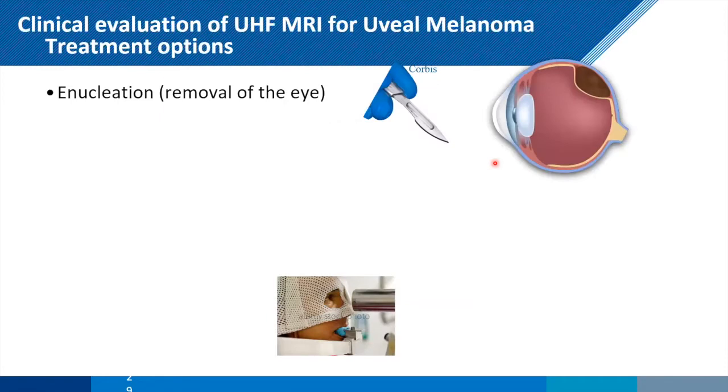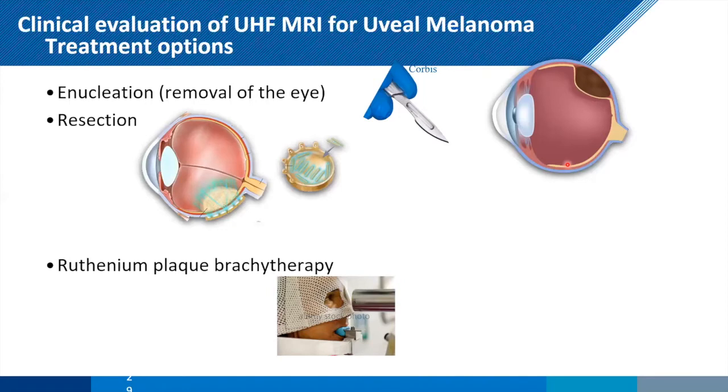And one example where it actually is used in patients and the results have an effect on diagnosis is looking at eye tumors. So uveal melanoma is the most common eye tumor. It's a horrific disease, mainly because the eye tumor will metastasize. So it's in the eye, it breaks through the back of the eye, it then metastasizes, and most patients die of liver cancer within about 6 months. And so it's something where enucleation, in other words, removal of the eye, is often used. But there are other options, because of course you would like, particularly in younger people, to maintain that sight.